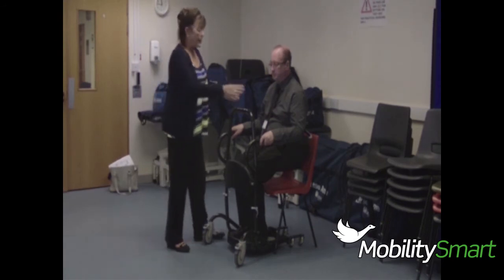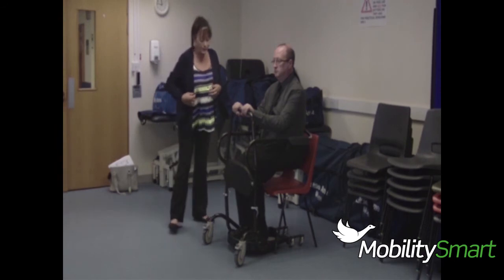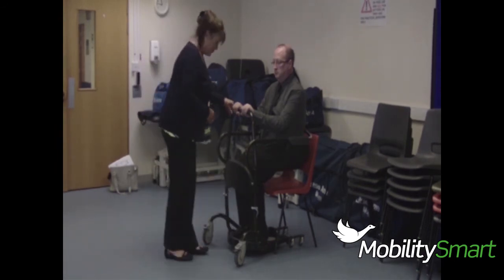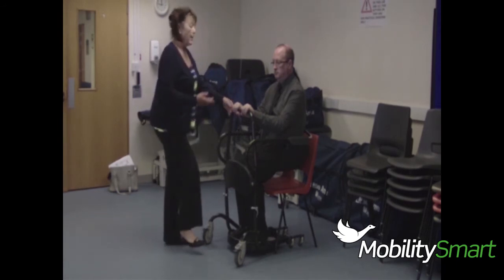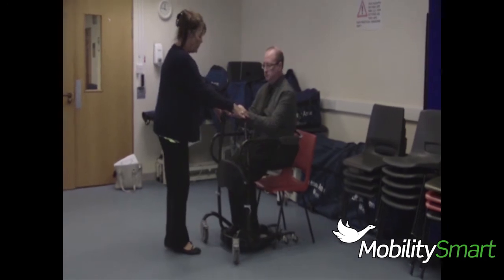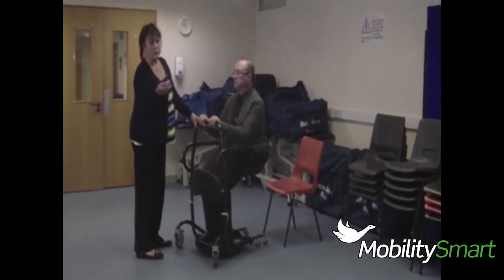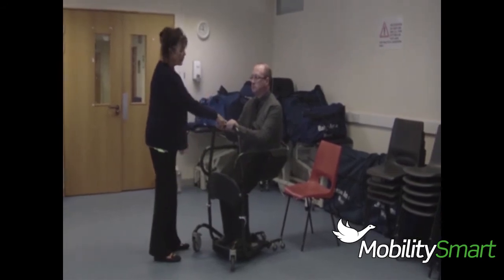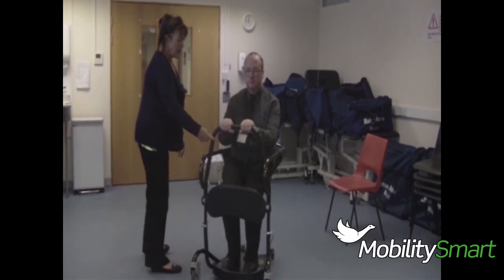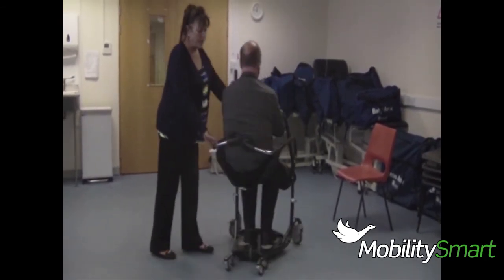So if we went through a tight doorway, it's the knuckles that are going to get it. Okay? So we're going to hold on to here. Also what that does is it promotes the good posture. So now we take the brakes off and we can move. The client will always travel forwards. So you can either pull from the back here, and it's very easy. This unit is very manoeuvrable. You can move somebody with one finger. Okay? And you can turn them right the way around, right within their own space, very easily.